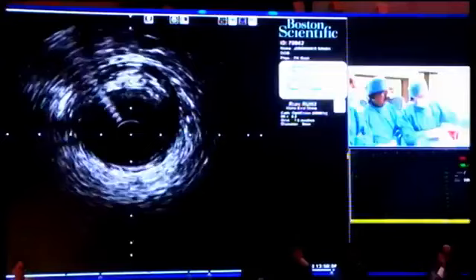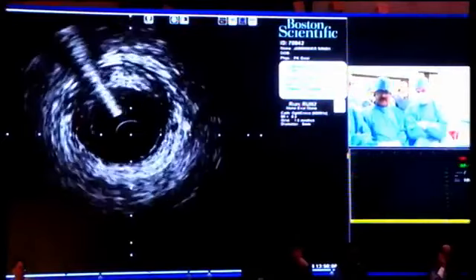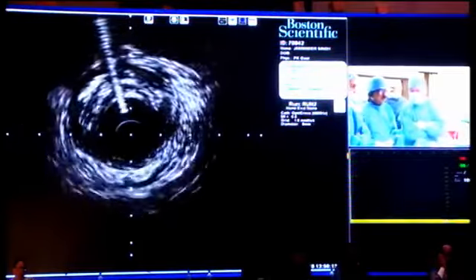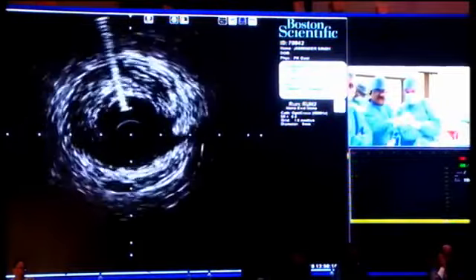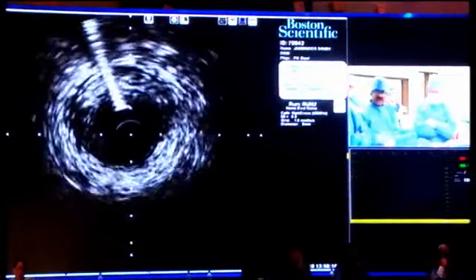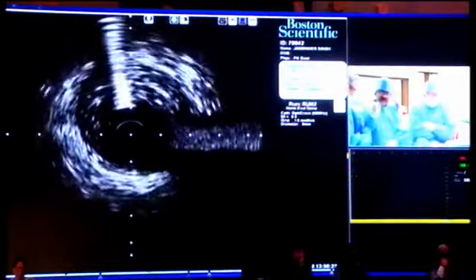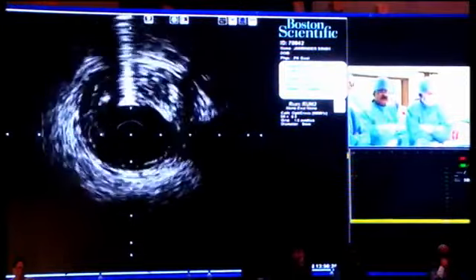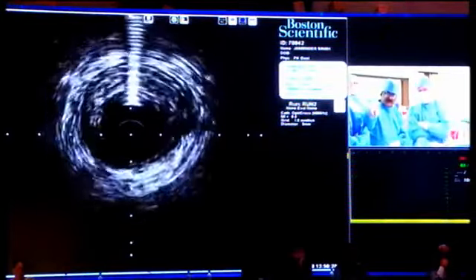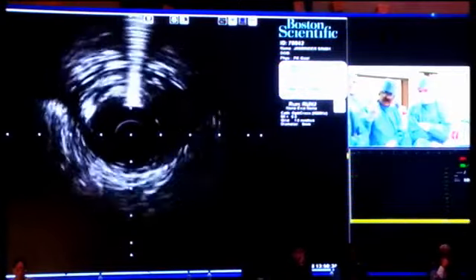Where the plaque is, now we are proximal to it. Now we are proximal. This is very slow speed, huh? Yeah, the speed is slow. I think we've crossed the main part. This is where the RV branch would come. Can we see fluoro? That's the RV branch there. And that's where our balloon was not giving way. I think there's a severe lesion there.